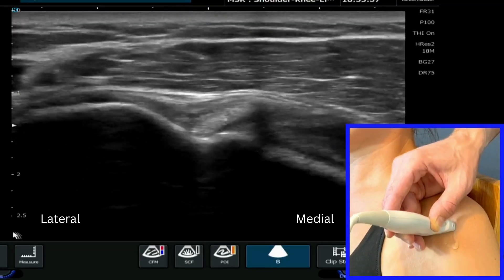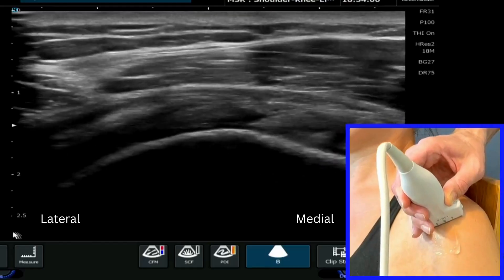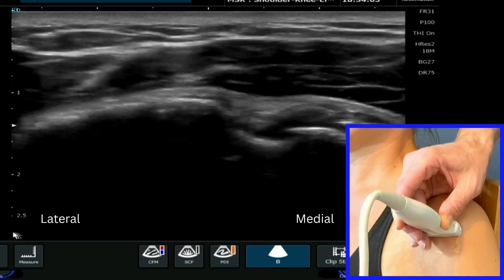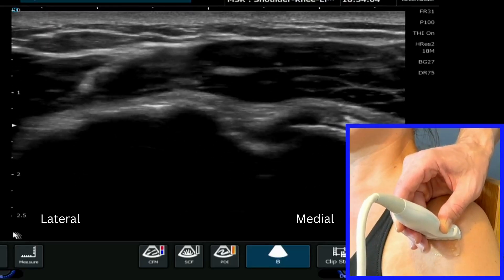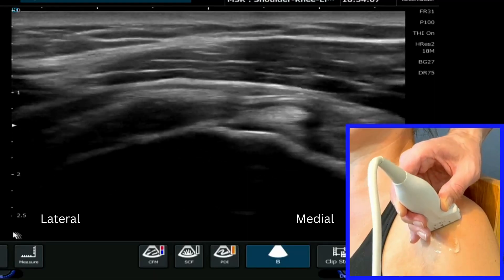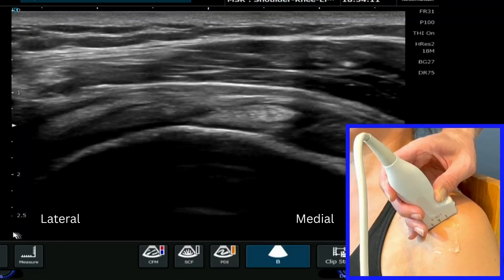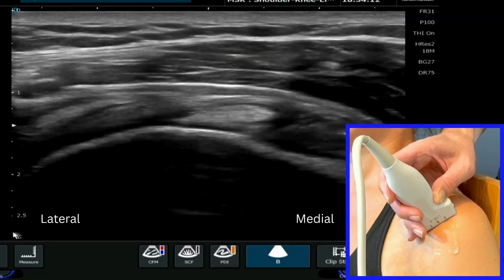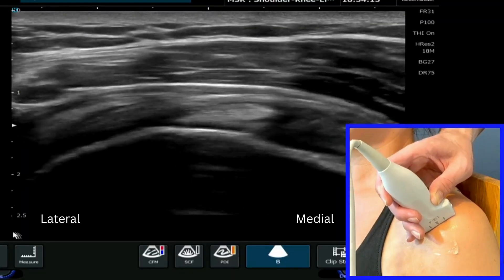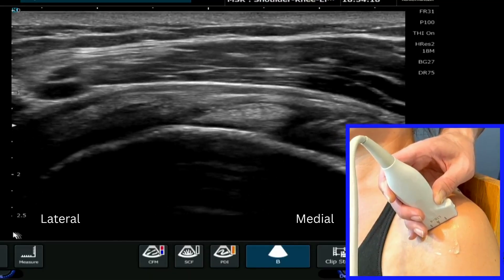I'm then going to bring my probe up onto the top of the shoulder, and you'll see the probe angulation moves slightly — the lateral aspect of the probe is going to turn around to face more medially. But we're going to keep that biceps nice and bright in the middle of the screen, and then we'll start to see this region that is referred to as the rotator interval.